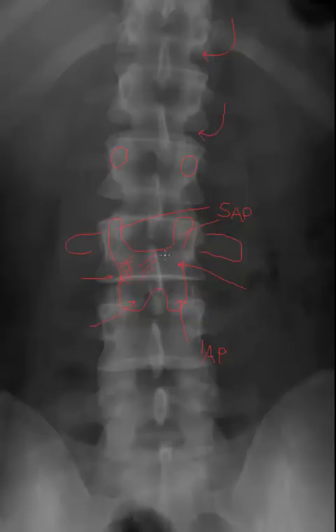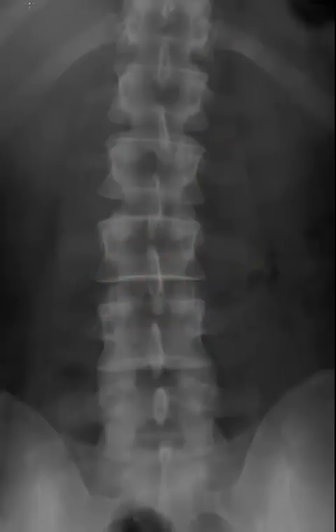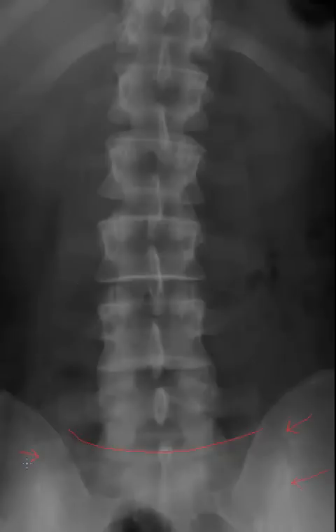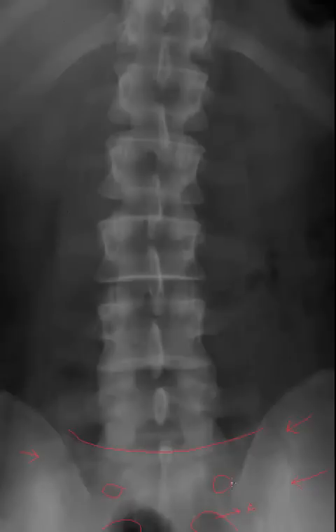Just next to the pars interarticularis is the lamina and, of course, the spinous process. These structures are seen well on the AP projection, and combined with the lateral we get clear visualization of all structures. Moving down to the sacrum: here is the sacral base, here is the sacroiliac joint visible on both sides. Depending on whether you have an AP lumbopelvic or AP lumbar, you will see a variable amount of the pelvis. You can also see anterior sacral foramina, which are almond-shaped, and posterior sacral foramina, which are P-shaped — a mnemonic so you can remember the letter they begin with to describe their respective shapes.